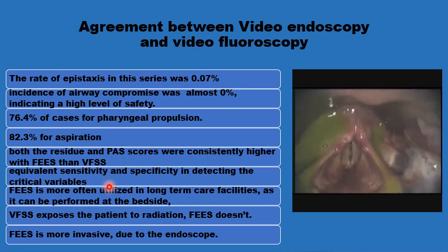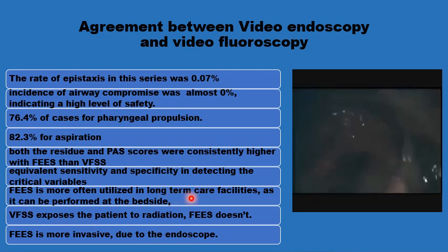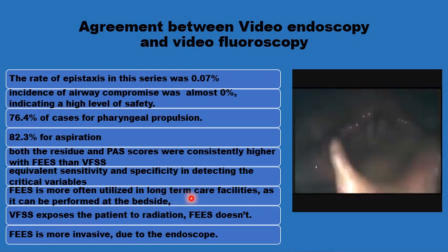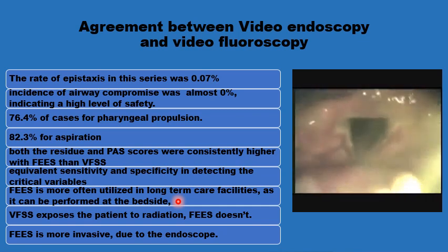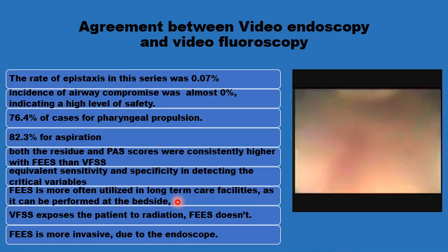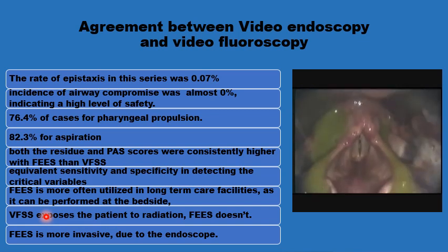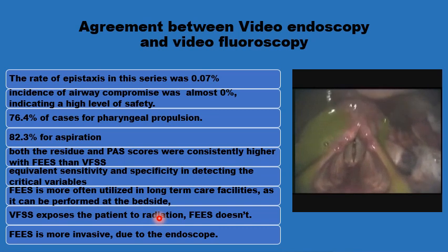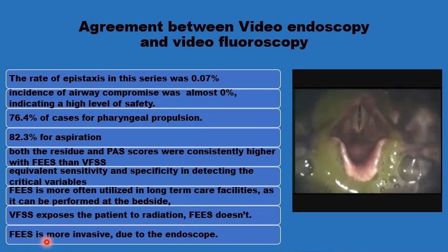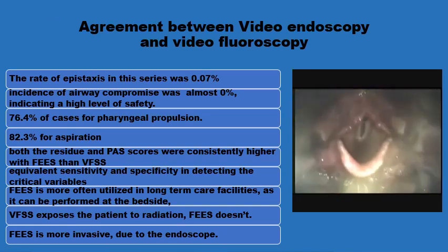The FEES is more often utilized in long-term facilities like care homes, because it can be performed at bedside, and of course the video fluoroscopy has to be carried out in a hospital setting. And there is also some radiation exposure during the video fluoroscopy examination. There is also some who would argue that FEES is more invasive due to the use of the endoscope.